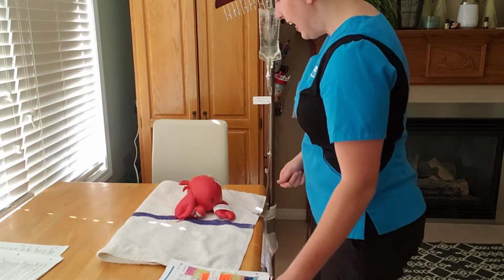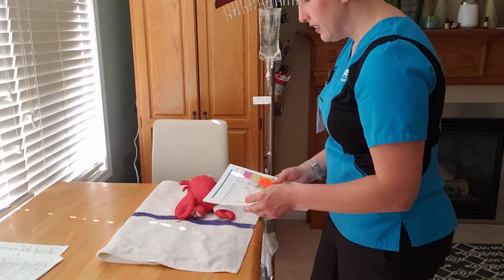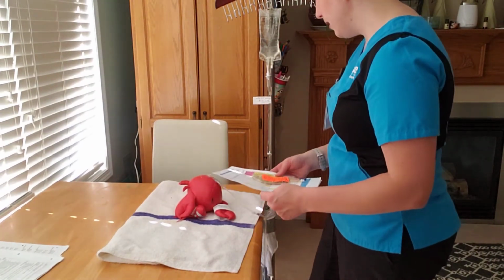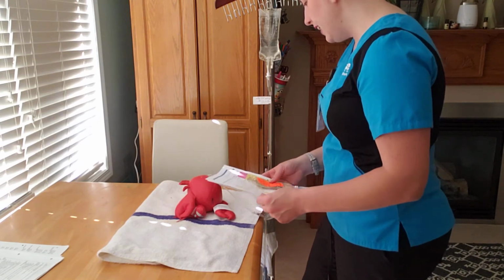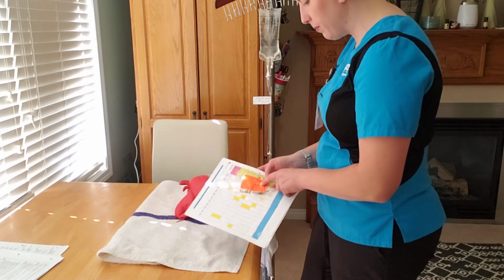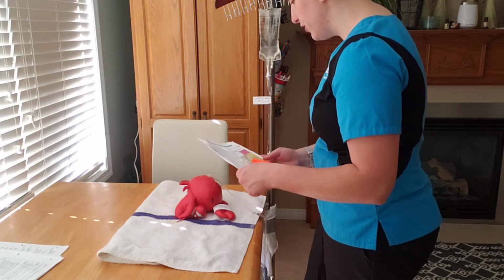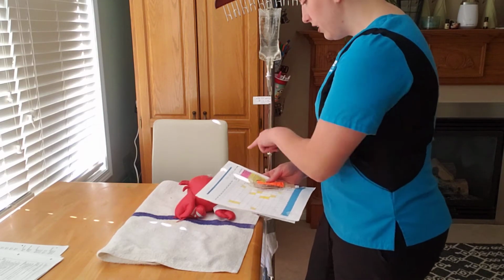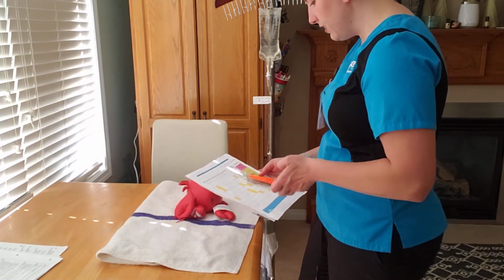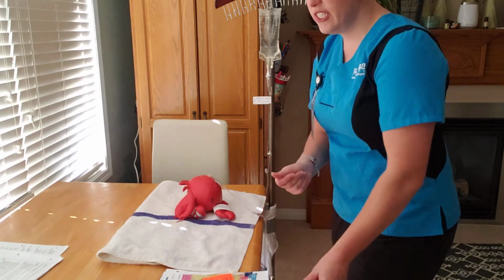All right. Allison, could you please state your first and last name for me and your date of birth? So here I'm going to check that against our mini bag and the MAR. She states her name is Allison Chinook. Her birthday is December 11th, 1960. So I don't have her birthday here, but I do have her health number, and I'm checking that to the bracelet. 614973042. So that to the MAR, to the bracelet, her name, to the bracelet, to the MAR, and to the mini bag. So her ID checks out. Allison, do you have any allergies? She states she does not.